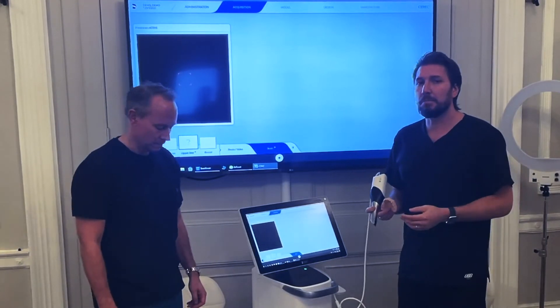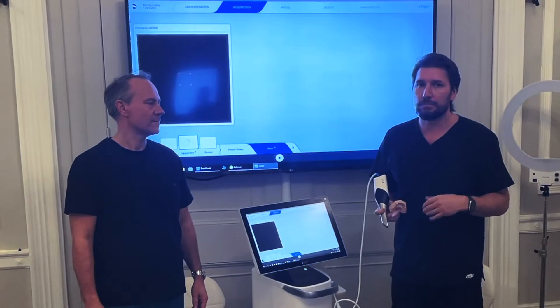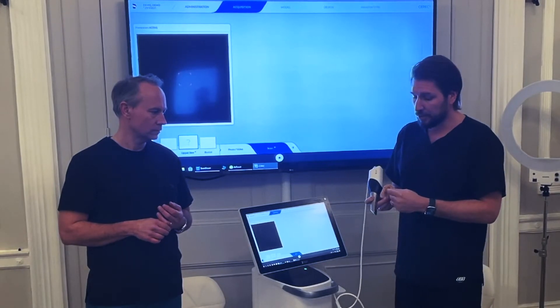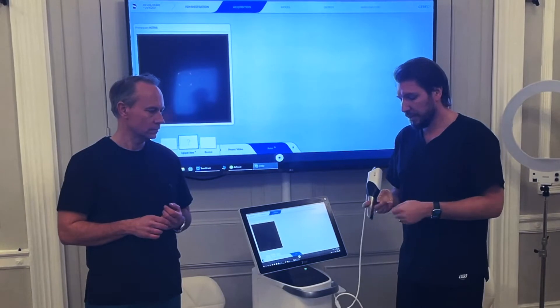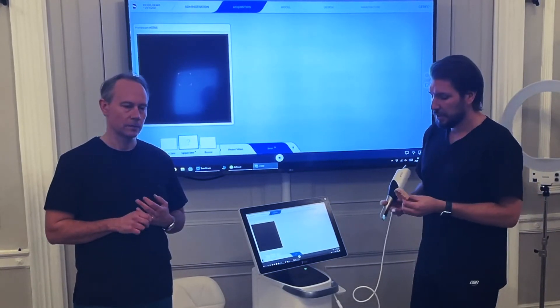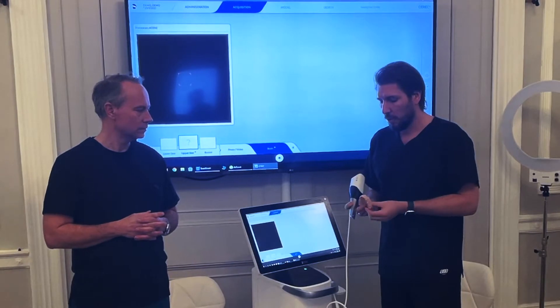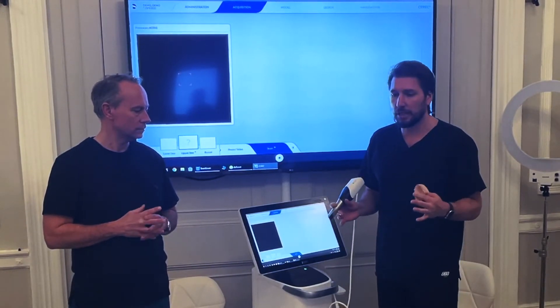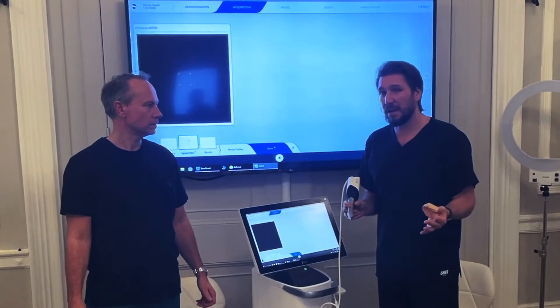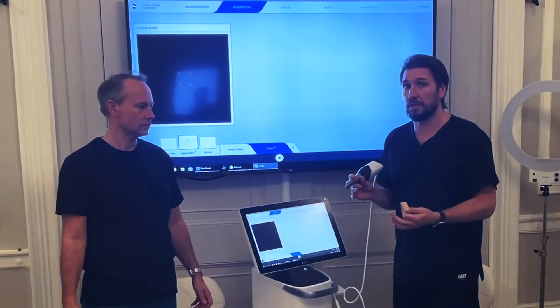Different manufacturer scans will have their preferred pathway. Personally I like to do the occlusal first, then the lingual, then the buccal — methodically, just like the scanning tool we made that you can download and print. The scan training tool is there to help you keep to a methodical path. Start with the occlusal so the buccal and lingual can merge together properly.